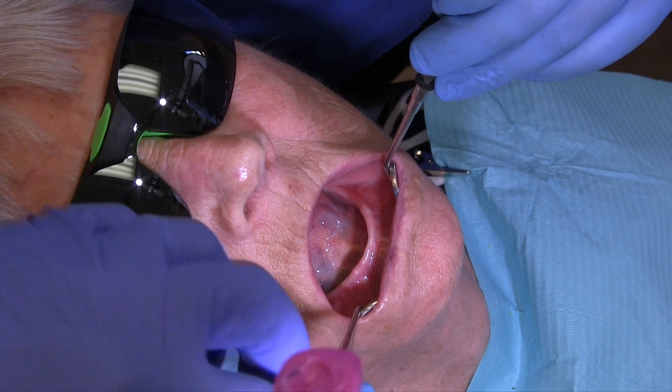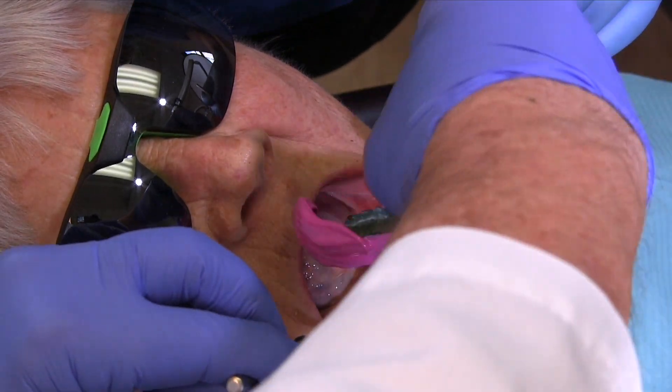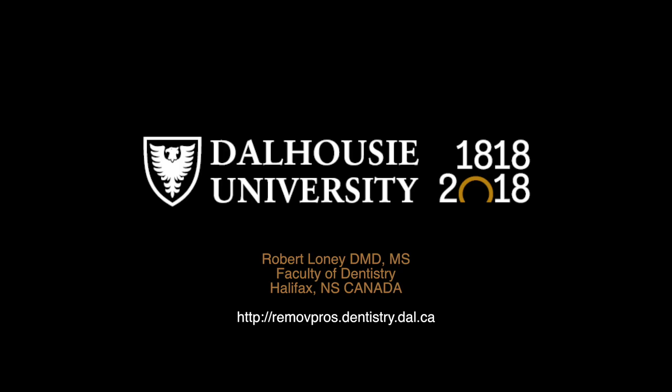The two-mirror impression technique is a method I developed to minimize voids and improve operator visibility and comfort. Try it for your next impression.